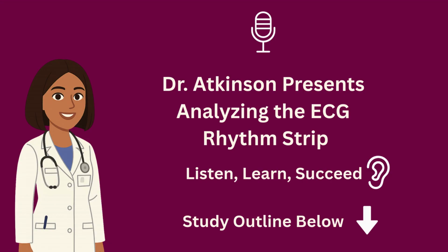Cardiac monitoring systems today can also provide continuous rhythm surveillance, complete with alarms that alert staff when the rhythm changes. While this technology is invaluable, it comes with a challenge: alarm fatigue. When too many clinically insignificant alarms go off, staff may become desensitized, ignore alarms, or even silence them. That puts patients at risk.